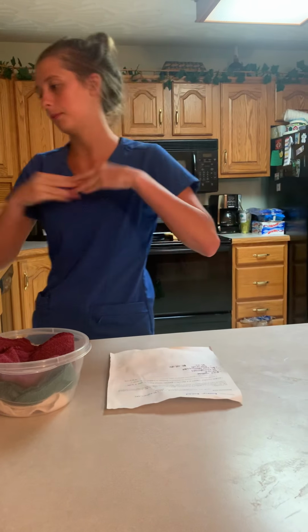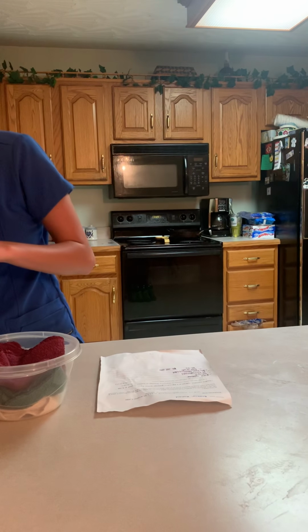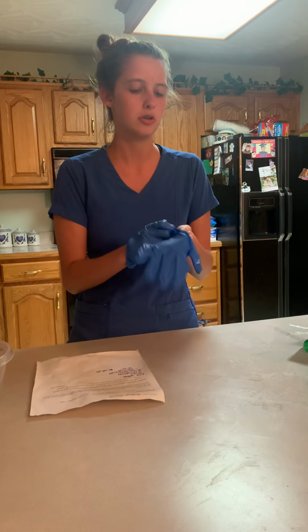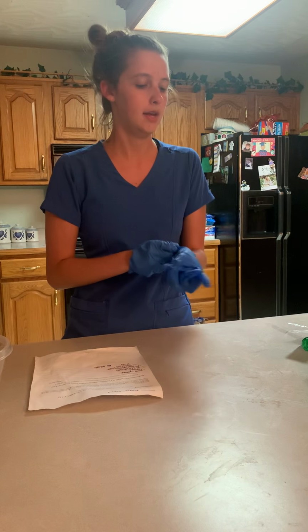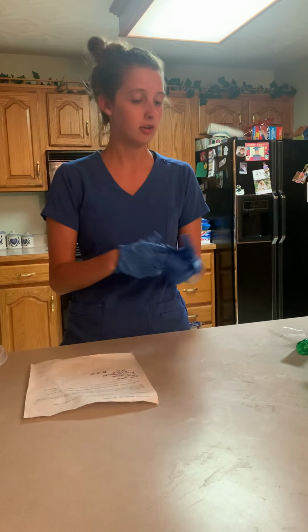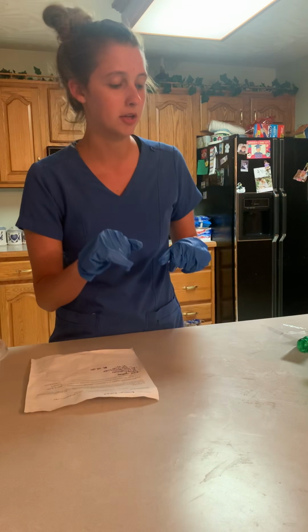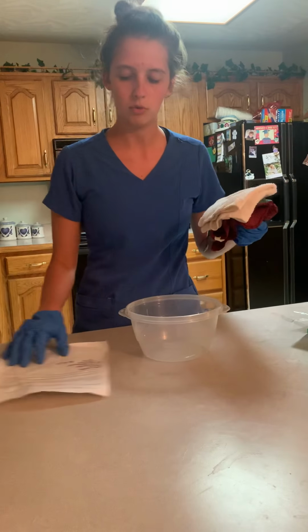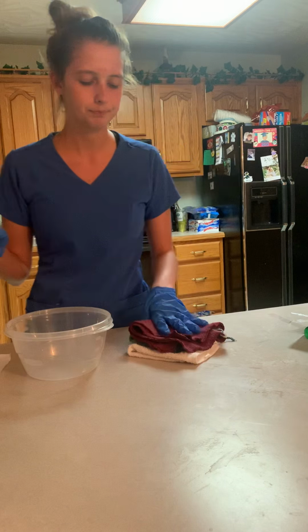So now I'm going to remove my gloves. I'm going to wash my hands. Okay, next what I'm going to do is get another clean pair of gloves, and we are going to assess to see if the patient needs any pericare done before the procedure. So we now have our gloves on, so we're going to assess, and the patient does need some pericare to be done before the procedure. So we're going to get our basin full of warm water and soap and our clean towels.